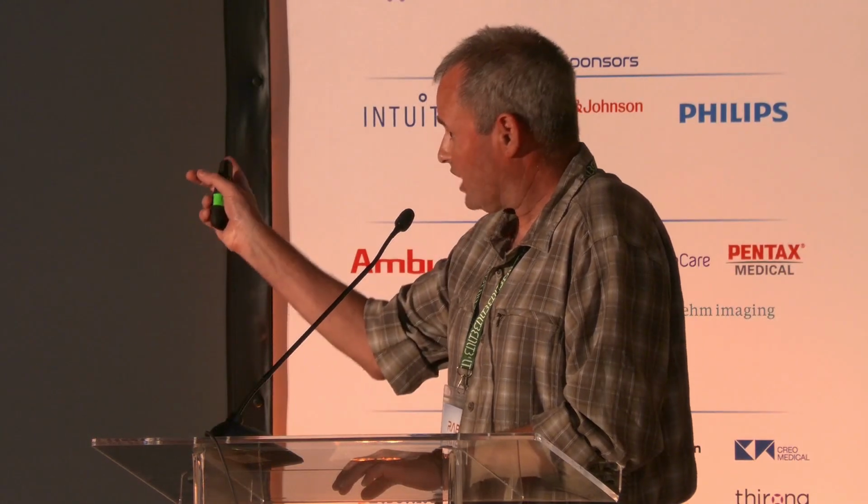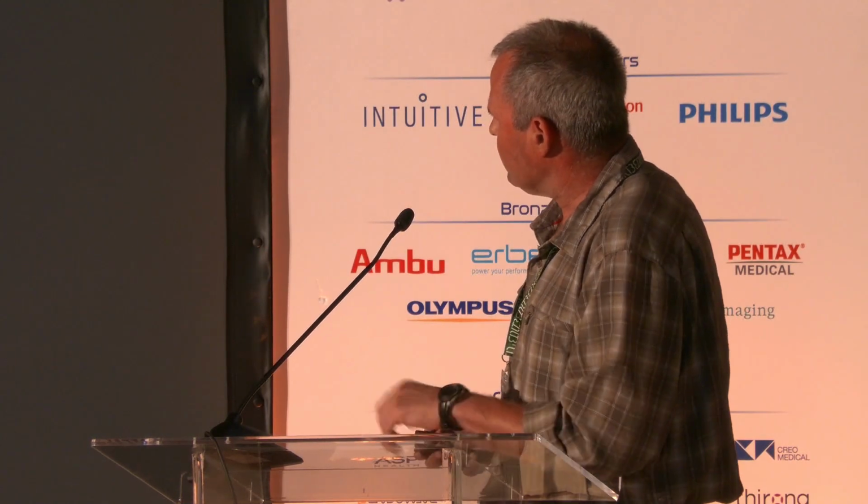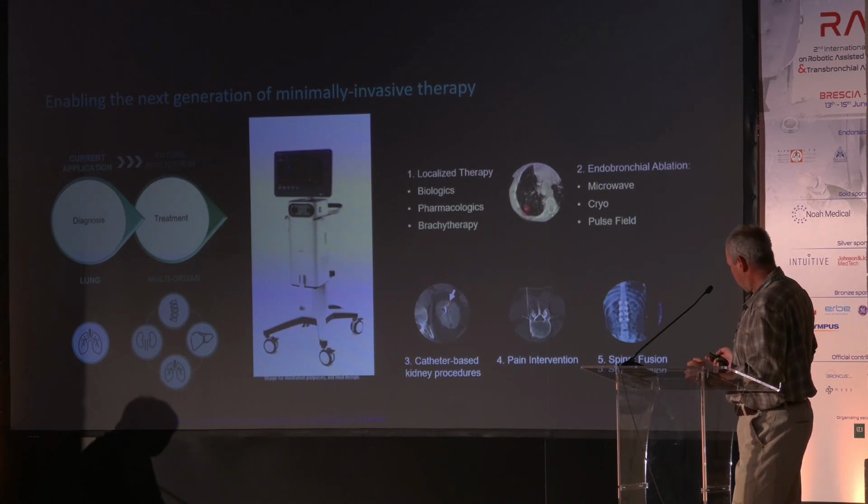This is my last slide. So the purpose of LungVision in the future is to actually improve the navigation, improve the bronchial tree reconstruction, and to make the intraprocedural image better, so we will be able to use it with ablation and even in other organs.